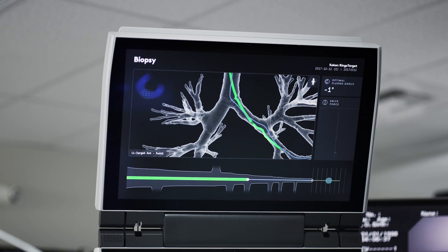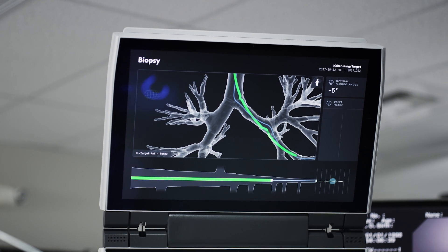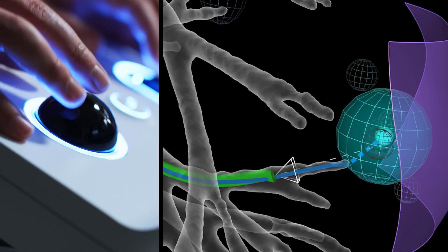After the vision probe is removed, you can rely on the shape sensor for real-time positioning and orientation feedback.